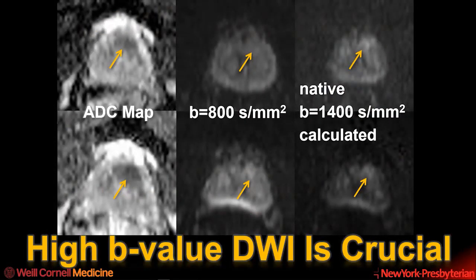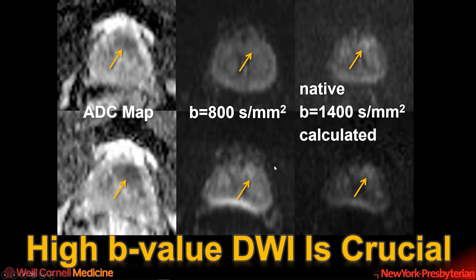The high B-value DWI is crucial for assessment. You can see that there's low signal in the anterior left portion of the prostate on the ADC map, and that this area looks iso-intense on the intermediate B800 DWI image. But the natively acquired B1400 and a calculated B1400 image, which is generated from lower B values, shows that there is focal hyperintensity.